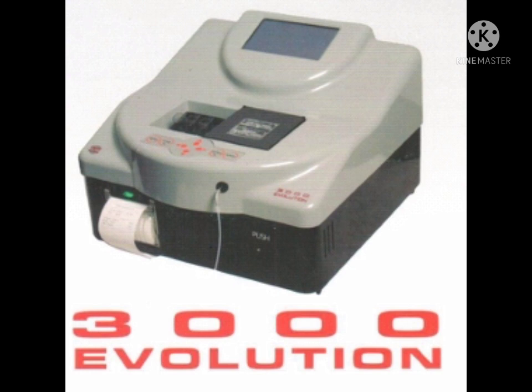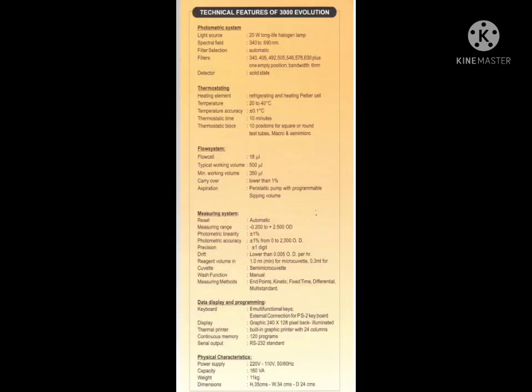Evolution 3000, it's a semi-automatic clinical chemistry analyzer manufactured by Biochemical Systems International, BSI, in Italy. In India, it is marketed by Tulip Diagnostic. The technical specification of this analyzer, starting with photometric system, the light source is halogen lamp.